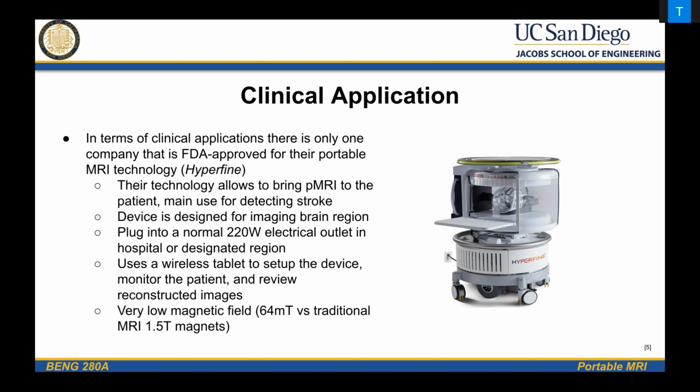It uses a wireless tablet to set up the device, monitor the patient, and review the reconstructed images. And just like Audrey mentioned before, it has a very low magnetic field, 64 millitesla versus a traditional MRI of 1.5 Tesla magnets.